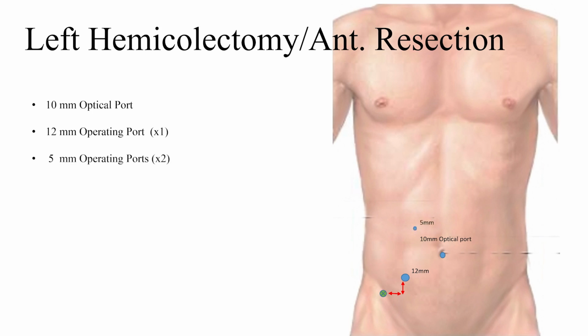An operating 5 mm port is then placed in the right upper quadrant, just medial and with a minimum distance of 1 adult fist to our 12 mm port. This is done in order to avoid instrument conflict when dissecting into the pelvis, when optimal manipulation angles are lost. Finally, we place an assistant 5 mm port in the left flank. We prefer a midline or left flank extraction for the specimen, using always a wound protector.